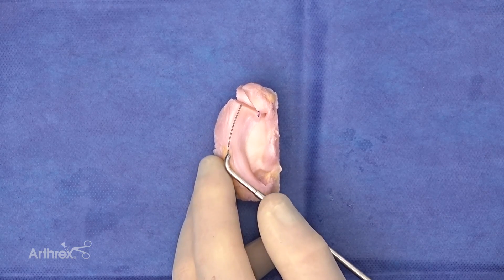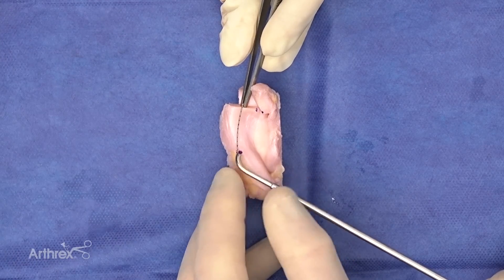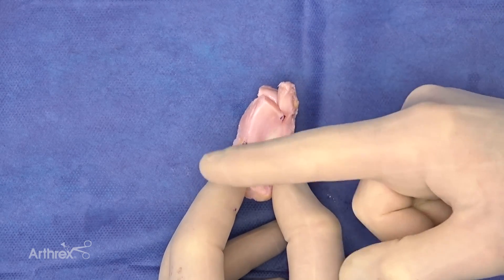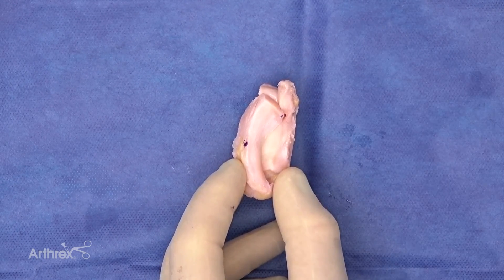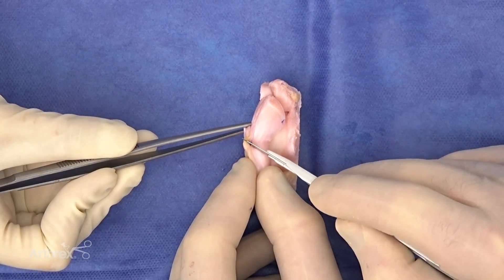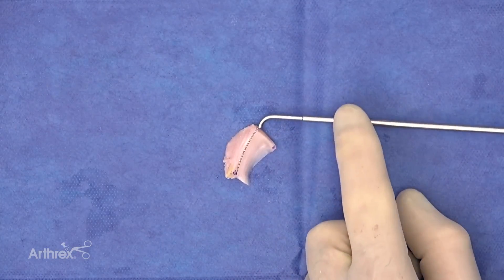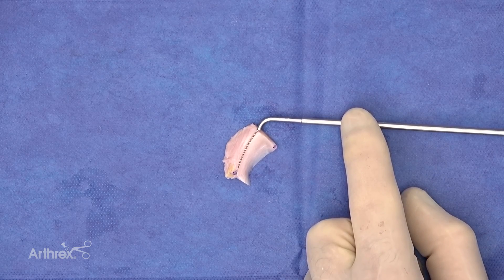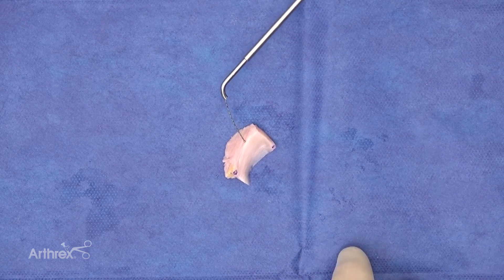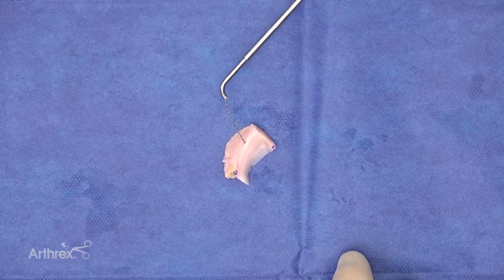Our experience has been to cut one millimeter less, so here's our mark — we're going to go to 24 millimeters from the mid portion of the meniscus where we measured, and make our posterior mark there. Now we make our second cut, which is slightly oblique in the opposite angle. We're right at 24, which is what we wanted — one less than what we measured intraoperatively. We're measuring about 12 to the rim. This is the working part of the meniscus: the circumferential hoop fibers — that's what we're trying to preserve.